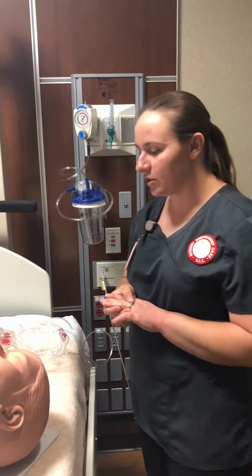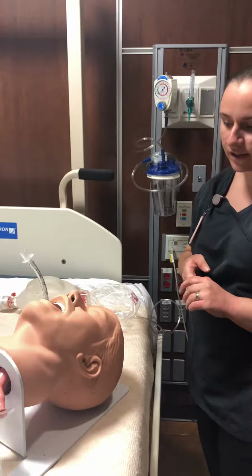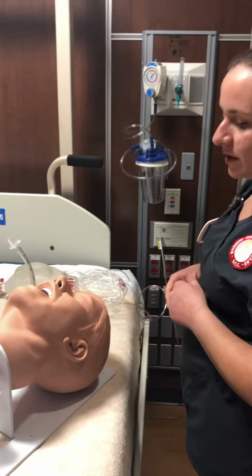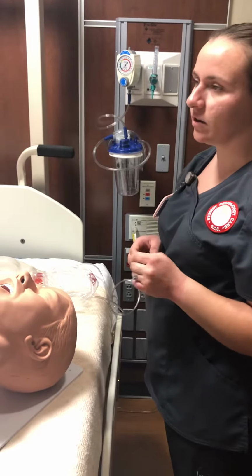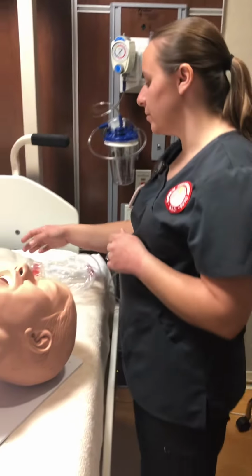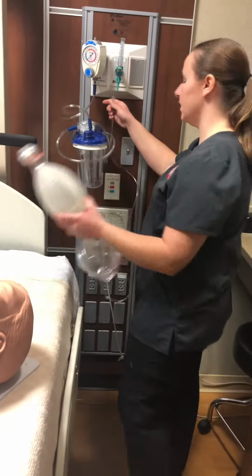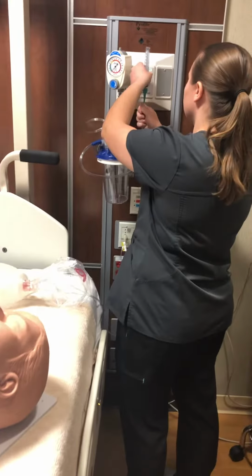Alright, so today I'm going to do a manual ventilation on a patient that has an ET tube in place. I'm going to assess the patient if they're already on a manual ventilator, and I need to use an ambu bag. I need to get the ambu bag ready and connect it to the oxygen source.